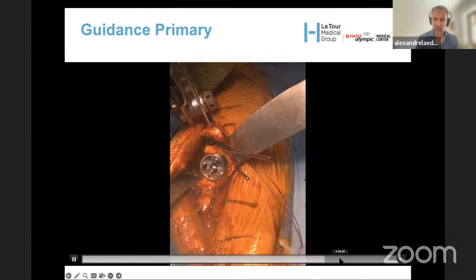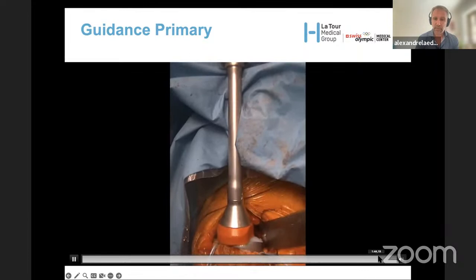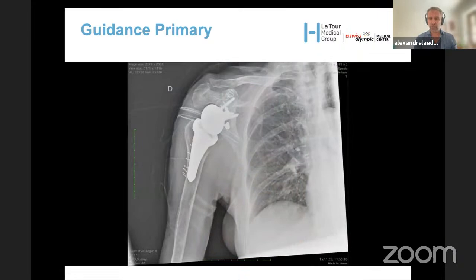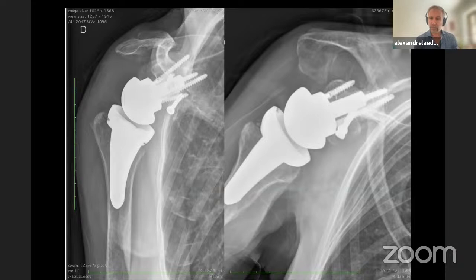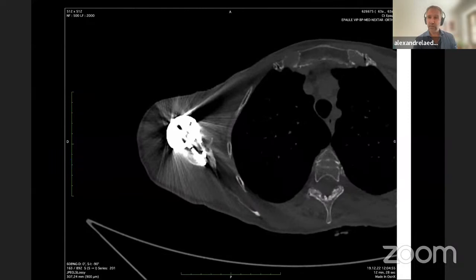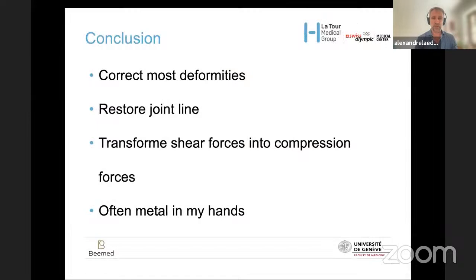I use a short stem, repair the subscapularis, and reduce the prosthesis. The patient I saw recently is doing perfectly well. This is for me the future for difficult revisions — navigation tells you exactly where you are even when the anatomy is hidden. The six-week postoperative X-ray and CT scan confirm the implants are at the right position — a nice result.